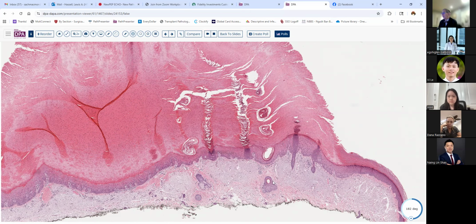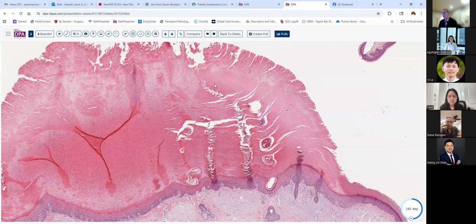And obviously someplace where you've got hair follicles. Now, as we look at this cutaneous horn, we see a couple of variations going through it. So it's not all very uniform. We have these pancaked or lamellar-like areas, maybe some cystic areas going up through there. What are these? The keratin pearls?